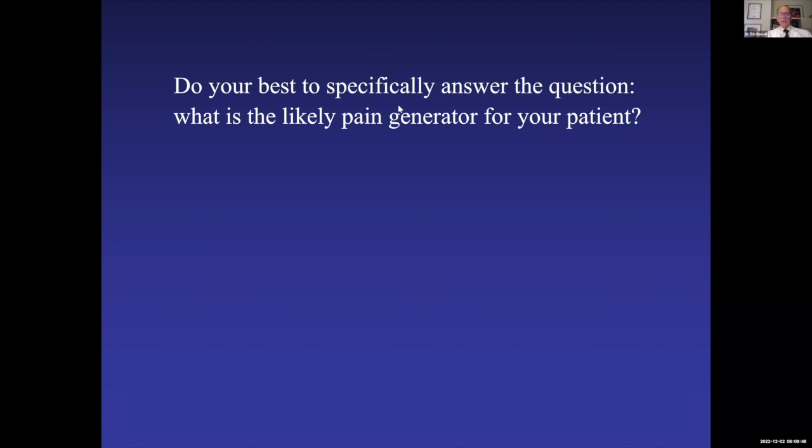And in fact, I didn't include it in the talk, but one of the limitations of cross-sectional imaging is it's really not possible to do good dynamic imaging. There are upright MR scanners and wide bore scanners where you can do a little bit of flexion extension in the bore of the scanner. But if you do a myelogram, the patient can be upright and bend and extend all you like and do lateral views and look at the degree of subluxation.